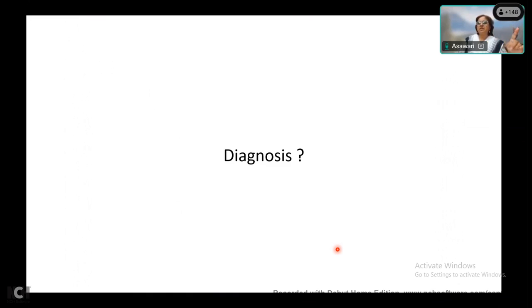But what is most important here is mitotic figures, and necrosis, and pattern. What kind of pattern is it? Follicular pattern. So now what? How do you want to classify that? Ma'am, follicular carcinoma with metastasis.